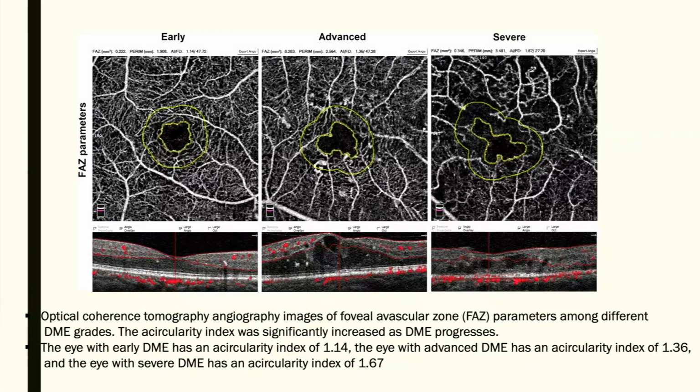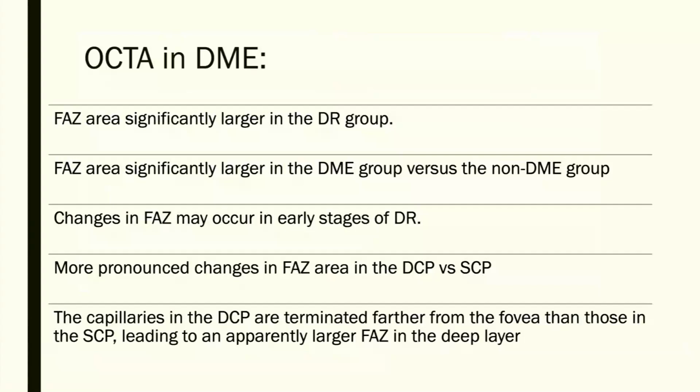And with DME, if you associate this kind of picture, this is what they call DRIL. See, OCT is showing you DRIL, where the lamination between various layers is not well seen. And the cause is underlying ischemia. You see how the blood vessels are already gone, and that is why there is ischemia. And in this kind of DME, however much anti-VEGF you give, even if the fovea becomes flat, the patient will not visually improve. You would have seen so many of these in your practice as well.